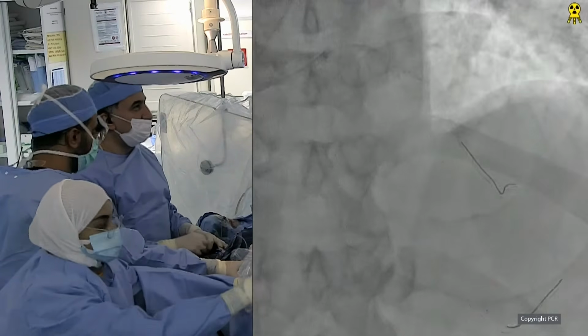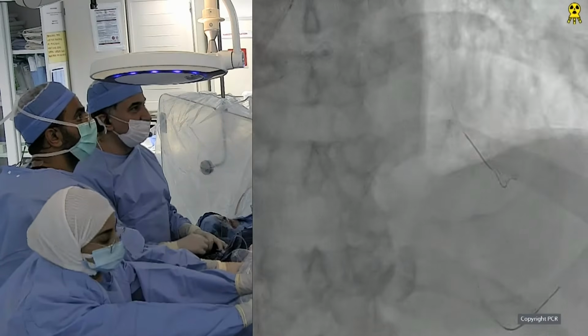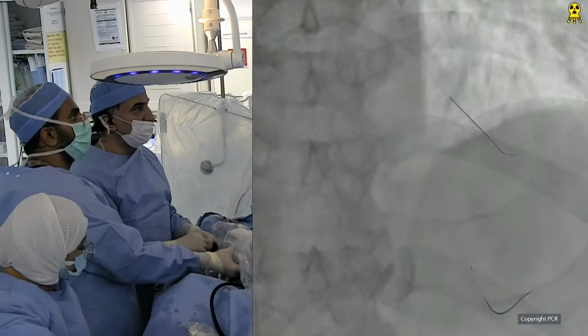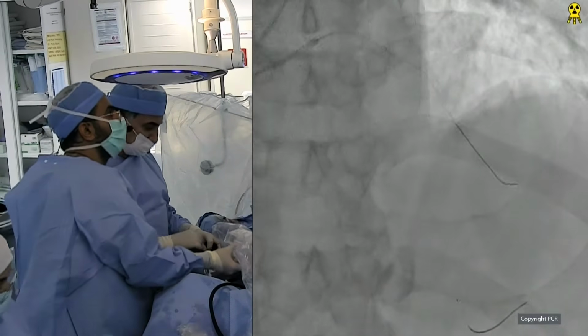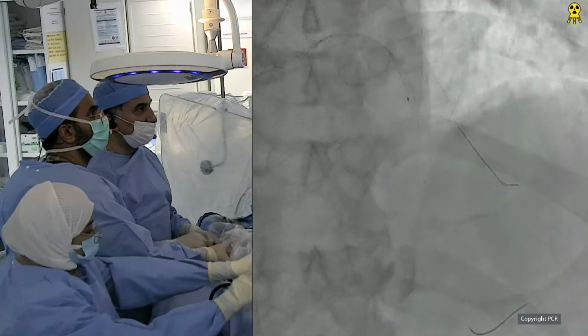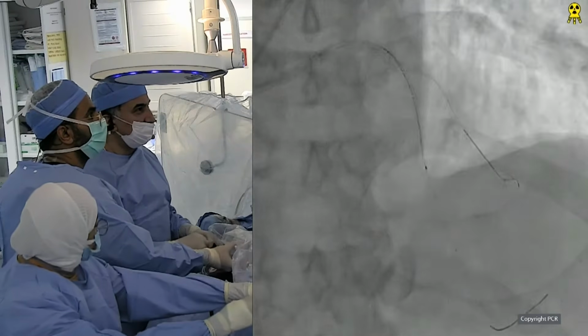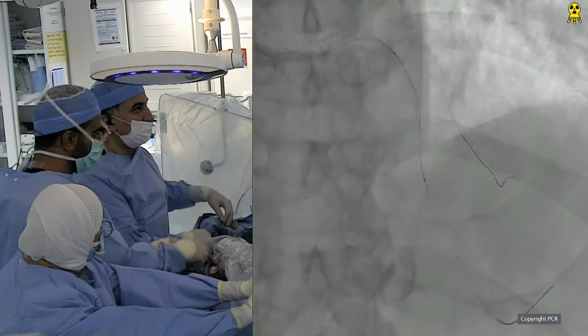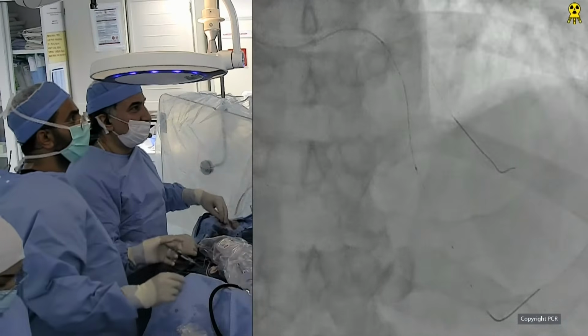Julio, at this point we focus only on morphology, length of disease, diameters, and where to land eventually. So the tiny point is at the tip of the catheter that is advancing, perfect. A little bit behind could be better, so we can see also the proximal part.